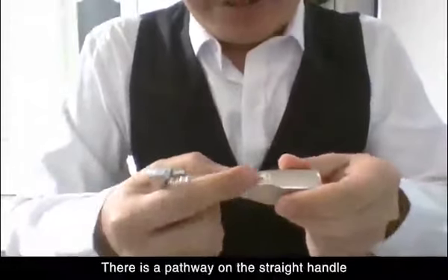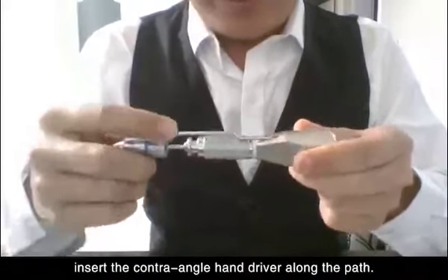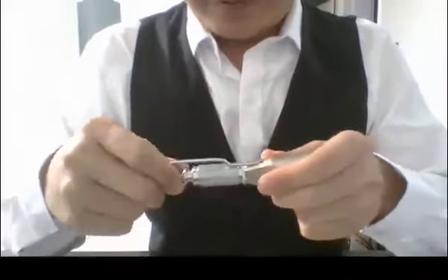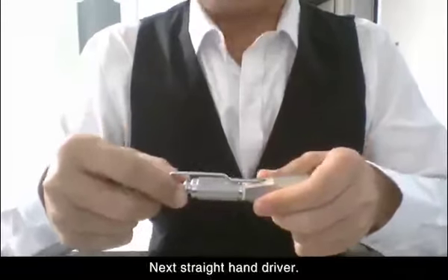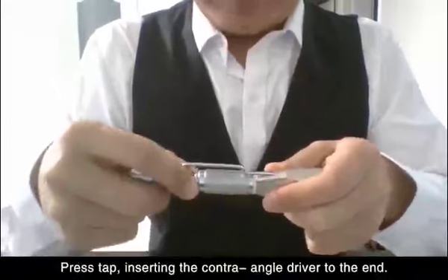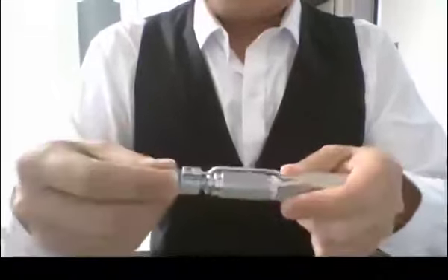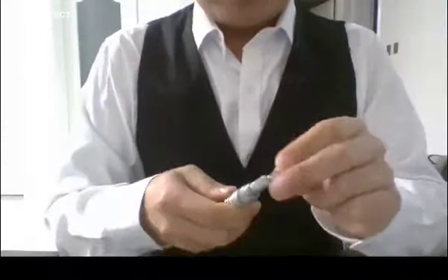There is a pathway on the straight handle. Insert the contra-angle handle driver along the path. Like the straight hand driver, press the tab, inserting the contra-angle driver to the end. Then it's okay. Pick up the micro-implant.